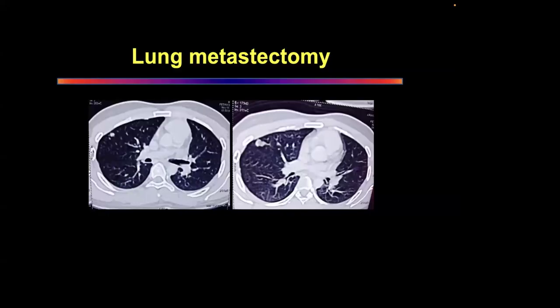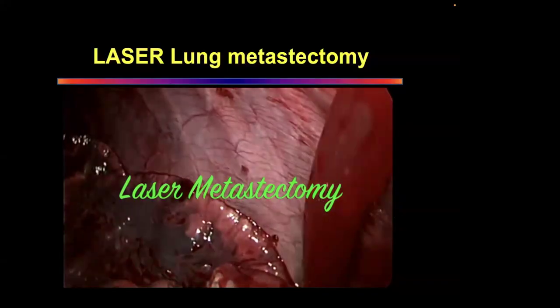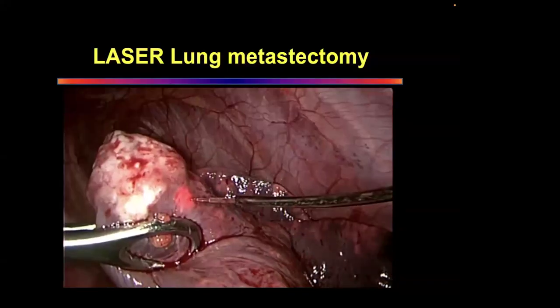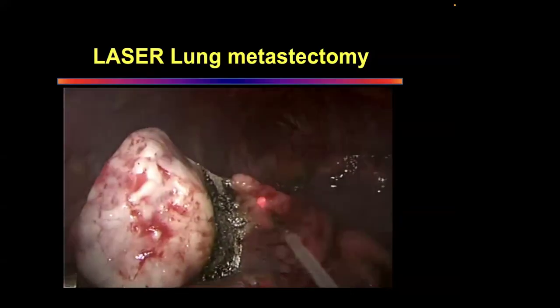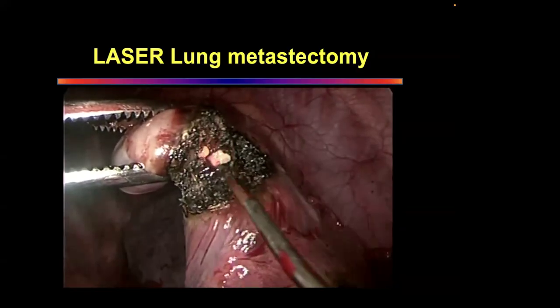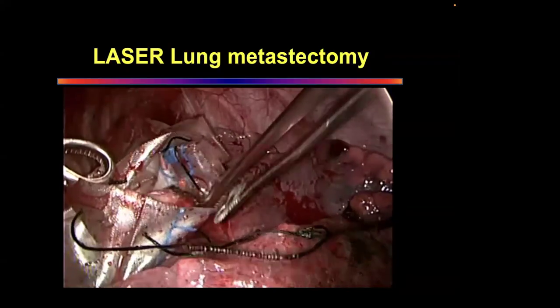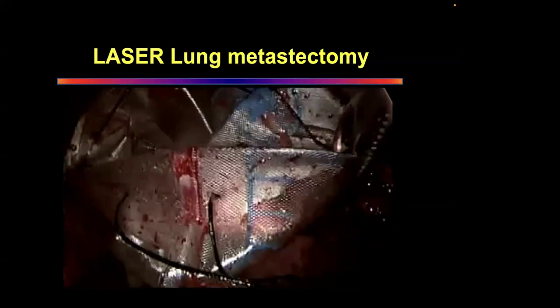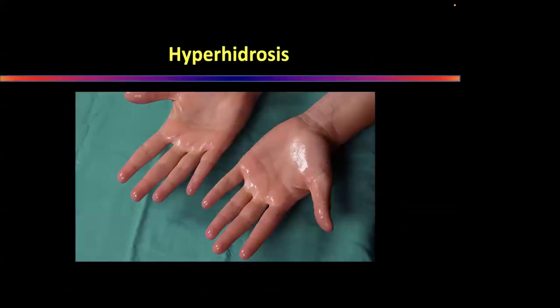Lung metastasectomy is done as an indication when the disease is limited to the lungs and we can remove all the metastases. In this particular patient, the metastases are from a malignant bone tumor, and we did the resection by laser. The advantage of laser is that we don't sacrifice much normal lung tissue, and there is no distortion of the lung parenchyma, which happens because of the staplers.